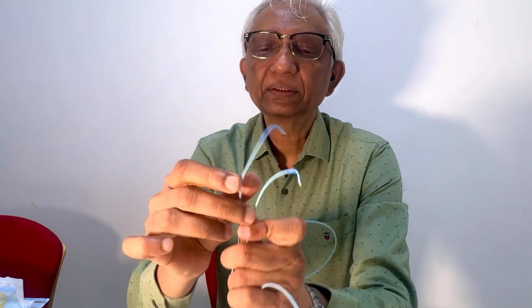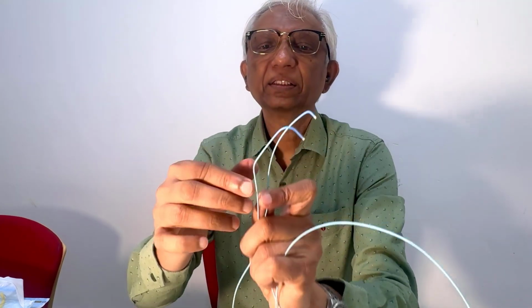Now this catheter often can be confused with the Cobra catheter with a double curve renal. So I'll show them all together. So the first thing, remember, the double curve renal catheter usually comes in a length that is much shorter. Usually it will be 80, but you look at the curve. Almost the same, but has got a small difference. And what is the difference? Just have a look at these two catheters. Okay, let's just see this.